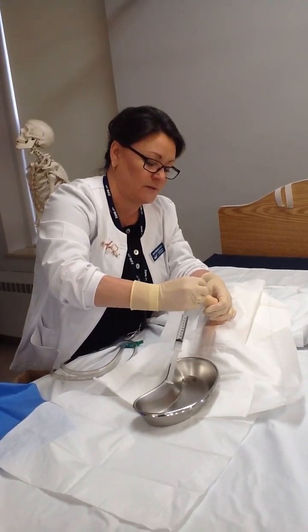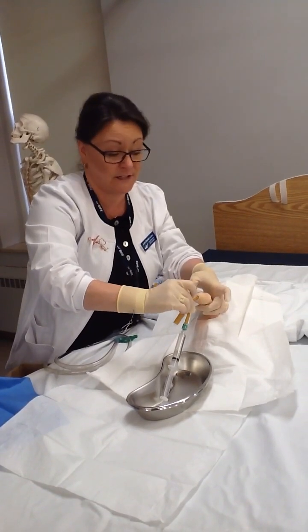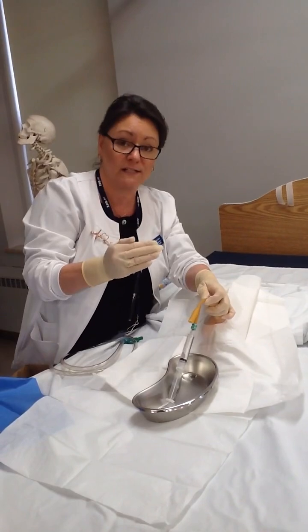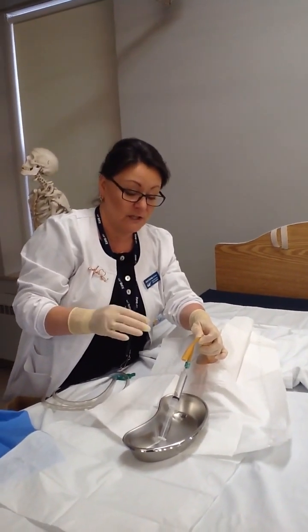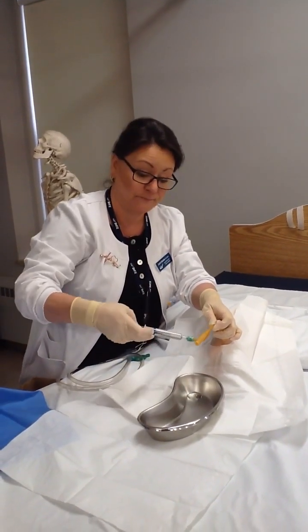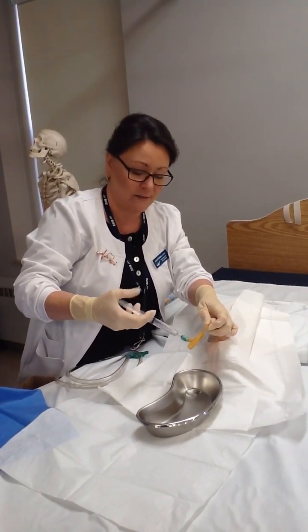And there we go. So now that I have it here and there's urine flowing out of there, my left fingers are going to come around and anchor that catheter in place because it really tries to push its way out in a real situation. So I'm going to secure it there. I'm going to reach down and grab my syringe, and now I've got to inflate that balloon, and I'll show you what that looks like at the end of the procedure.